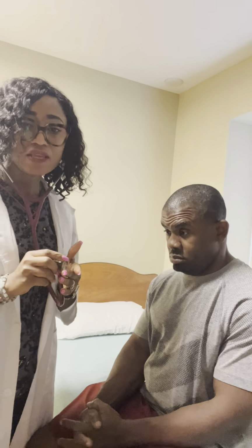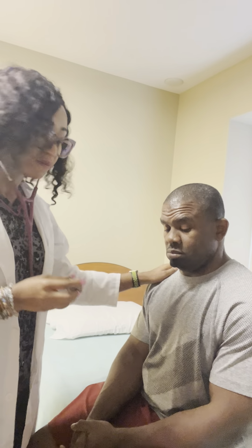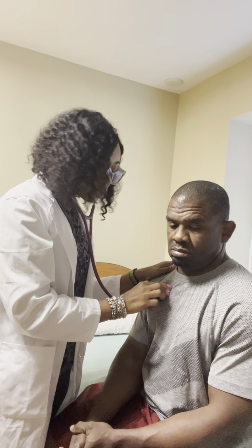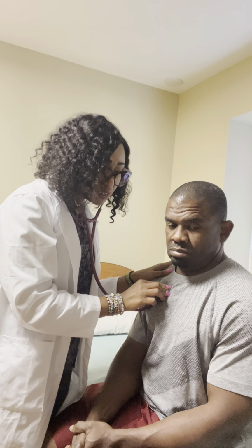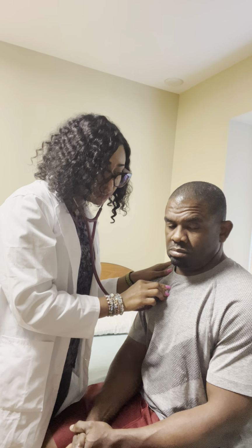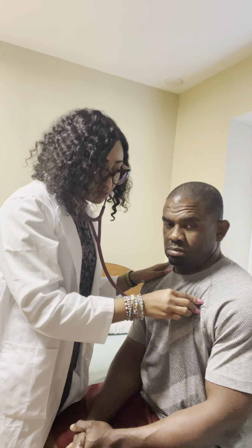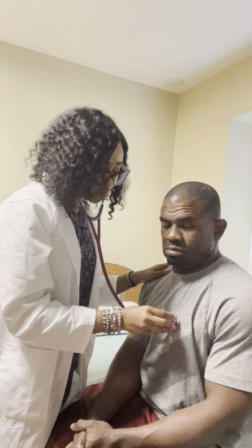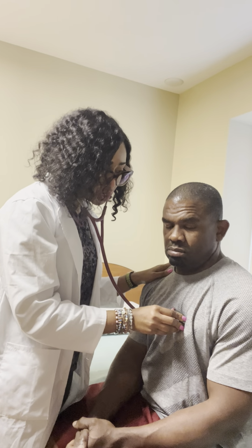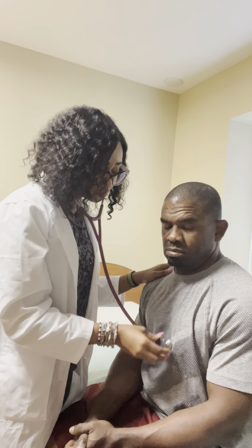And I will go ahead and use the bell of my stethoscope to listen for bruits. I'll start again, listening from the aortic valve on the second intercostal space to the right sternal border. Pulmonic valve, second intercostal space to the left sternal border. Erb's point, third intercostal space to the left sternal border.